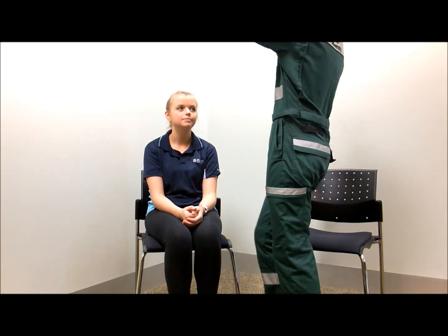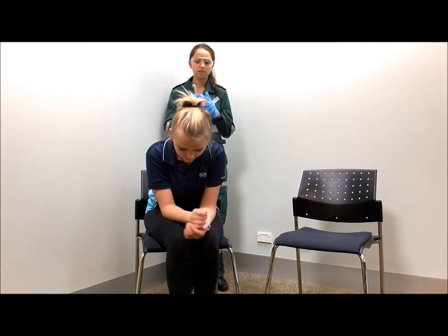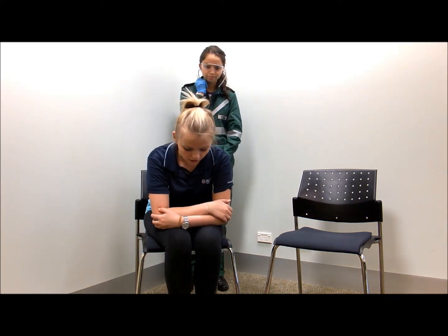Now I'm going to demonstrate how to auscultate Mrs. Jones's chest. Mrs. Jones, is it okay if I have a listen to your chest? That's fine. Okay, let me know if you feel uncomfortable at all and I'll stop. Okay. So I just need you to lean forward for me. Yep. And take 2 deep coughs for me.